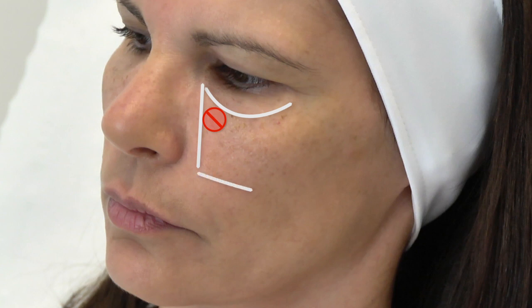Mark the lower limit of the cheekbone by tracing a line from the perialar triangle to the tragus. General rule to respect: above this line, administer an injection into the deep dermis and hypodermis and/or an upper periosteal bolus injection and an upper periosteal and subcutaneous injection to improve the lateral zygoma area in order to connect the areas around it. Below this line, inject into the deep dermis and hypodermis only.